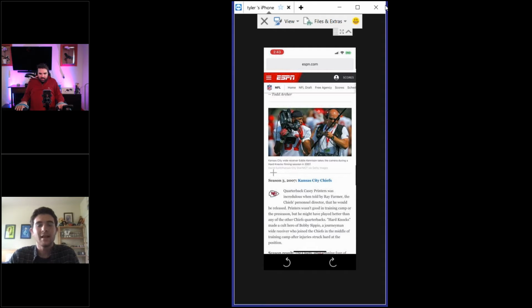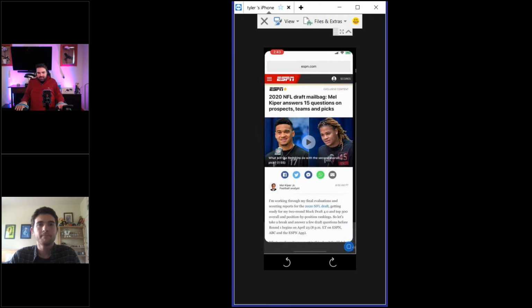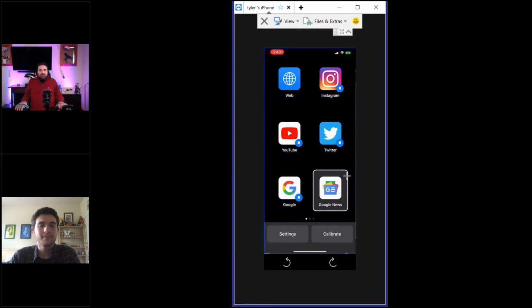and then go back home. Another easy gesture. Yeah, and this is super easy to use. Like, I haven't been practicing with this for months or anything, so it's really user intuitive, and I think pretty much anyone can use it. I think maybe the most important thing is just getting the settings calibrated.